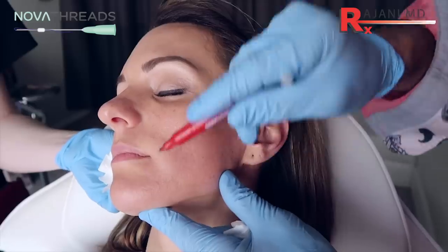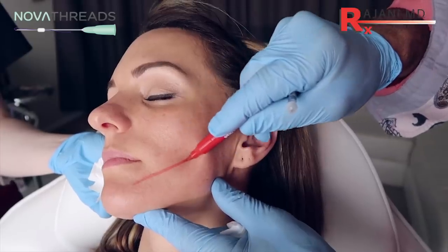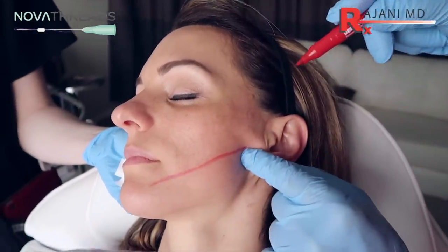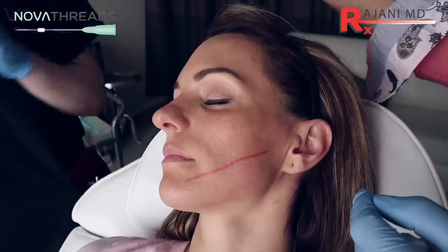The vector is going to be different on just about everyone. I go across the fold — some people start here, but I like to go through the fold and get a straight shot to pull that up in this direction. You could add a second, third, or fourth thread if the patient needs it and has quite a bit of ptosis.